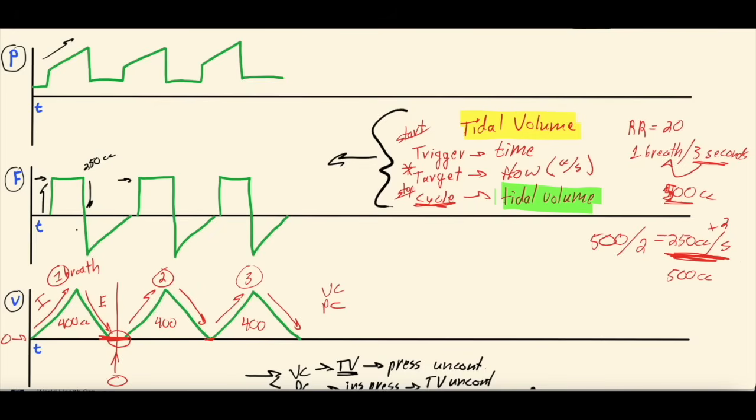This is inspiratory flow. And then this is negative because the patient's starting to expire. So this portion here, the positive portion, is inspiration. This portion here that goes all the way down to the negative portion is expiration, because this here is 0 flow. Right? So now there's no flow when the breath is done being expired out until they inhale. You get your set flow rate. It holds that flow, 250 cc's per second. Okay, I got my tidal volume. I got to my 500 cc's of tidal volume. I'm going to just drop the flow, right? It just goes all the way back down to 0. But then the patient starts to breathe out and expire until it goes back to 0 when the patient's breathed all the air out. Right?